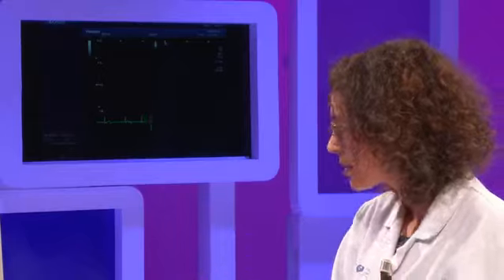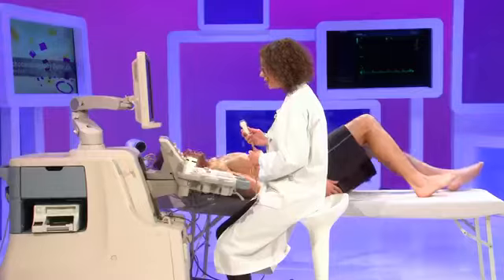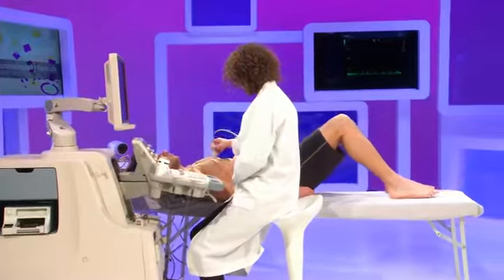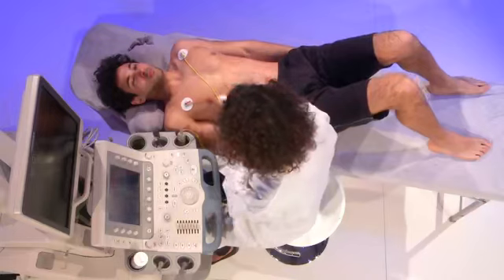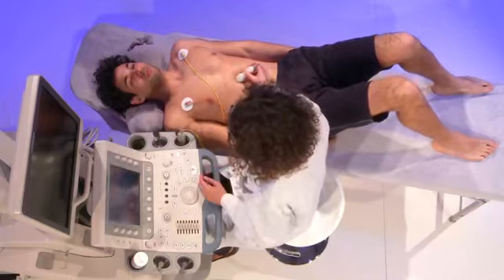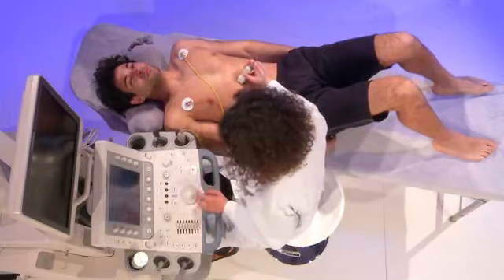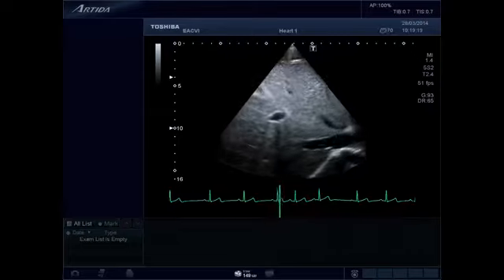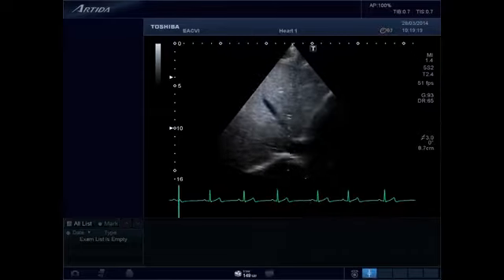Okay, so now let's move to the subcostal view, so I will ask you to go again here. The last acquisitions that I can do in Mmode, so I put again the marker this way. Sometimes I can assess the diameter of the inferior vena cava with a Mmode.